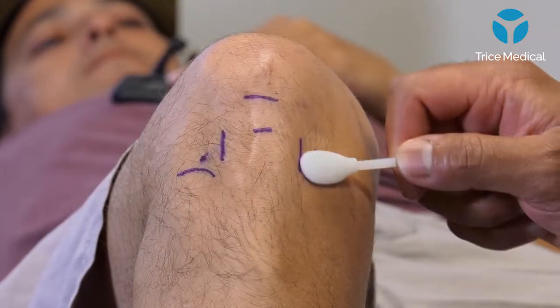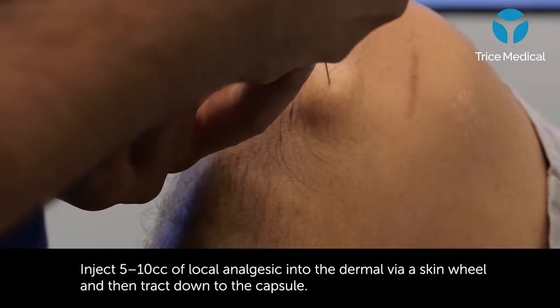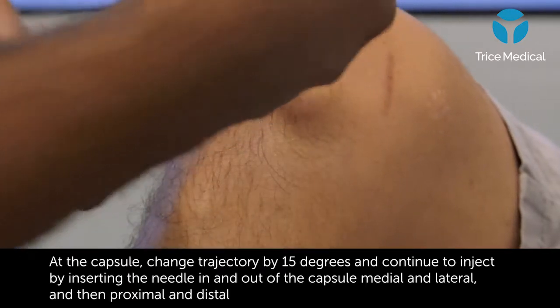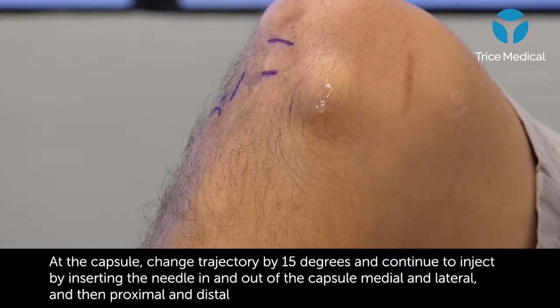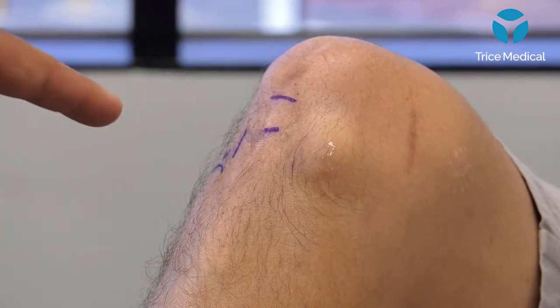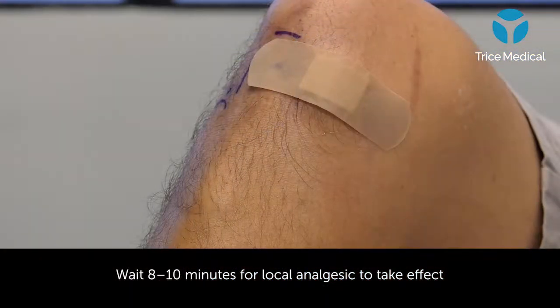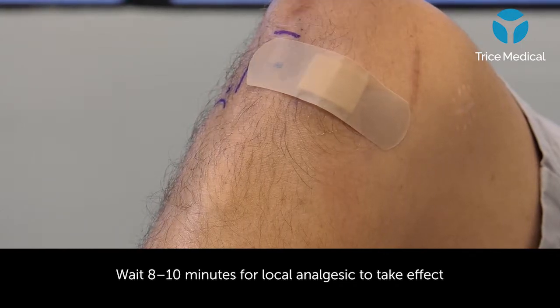Simply, let's say you're going medial — what I do is I create a skin wheel, so then I make a big wheel. The most important thing is to go in and out; when you're inside the intra-articular portion I don't put any lidocaine in, but I come out back to the capsule, and that big wheel is really important for marking. Then lastly, I'll put a band-aid at this point so the poke hole doesn't leak. I tell the patient you have about 8 to 10 minutes to just relax while the numbing medication kicks in.